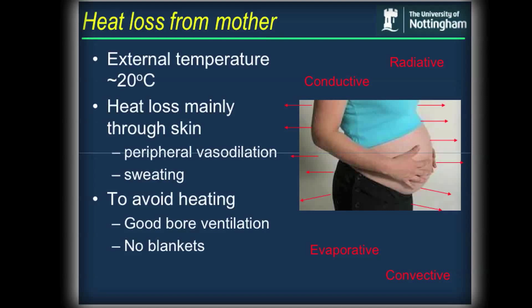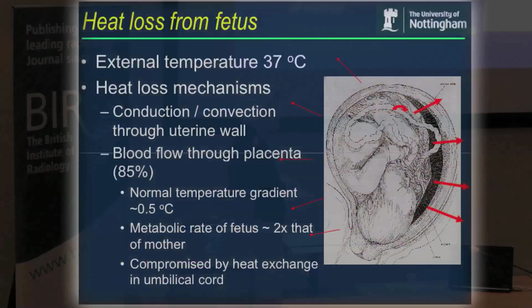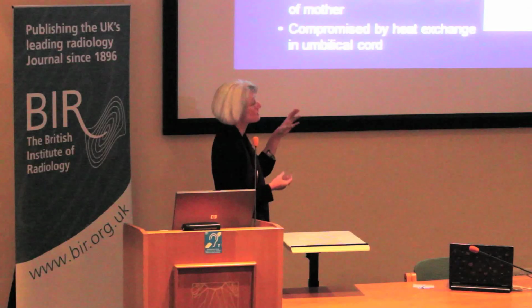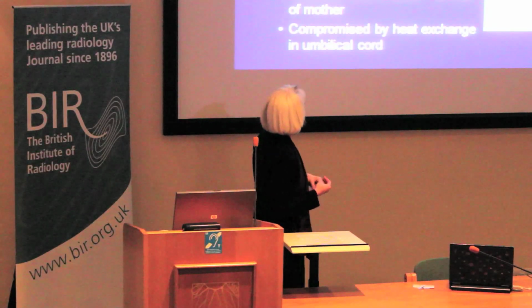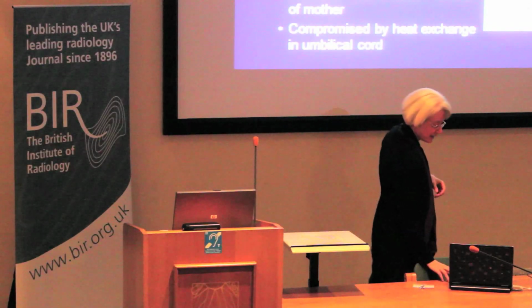But in the fetus, the heat loss mechanisms are much more compromised. First of all, the external temperature is 37 degrees C, so it can't lose heat by the normal processes. Normally, to lose heat from a cup of coffee, it's the temperature difference between the coffee and the surrounding room that leads to heat loss. In the case of the fetus, the temperature difference between the fetus and the surrounding environment is virtually nothing. Actually, the fetus is slightly hotter than the mother because it has a slightly higher metabolic rate.